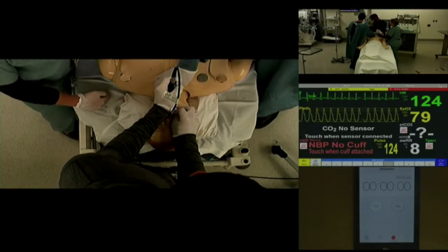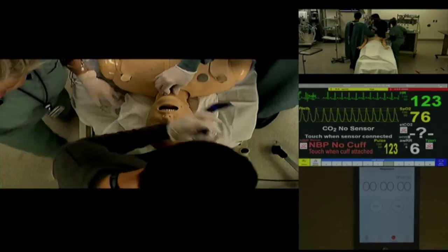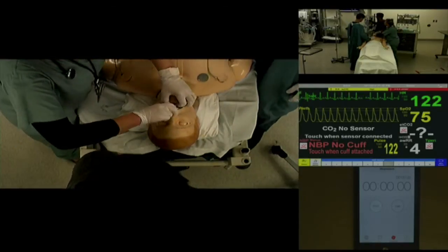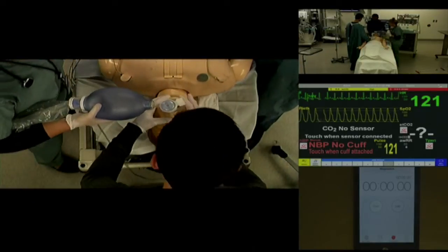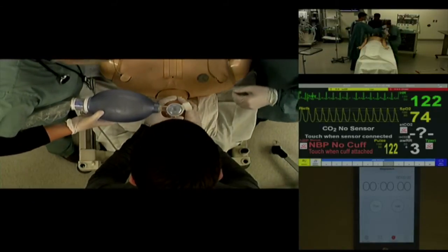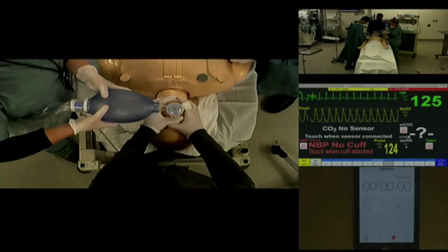If you can't get a view, come out and we're going to bag the patient. Coming back out. Let's do a two-person ventilation technique here. It's been hard to ventilate from the outset. Let's see chest rise — still not ventilating very well. Minimal chest rise.